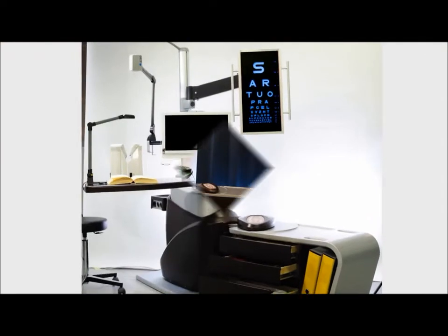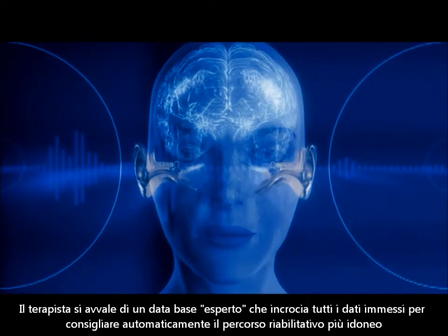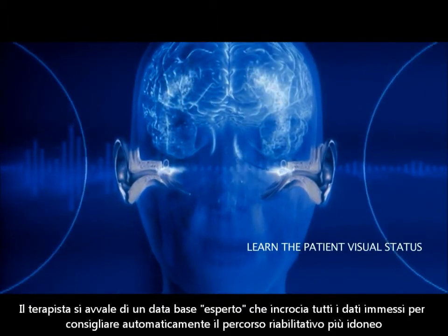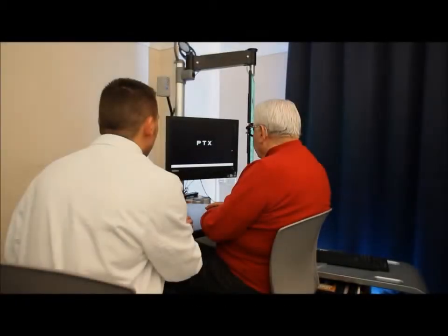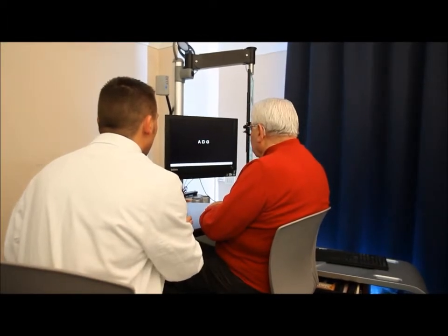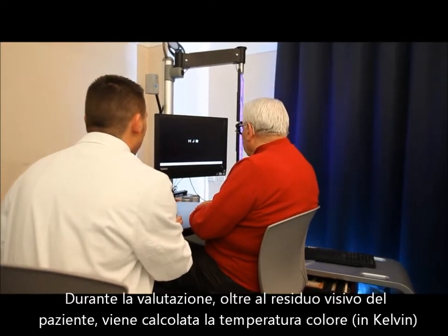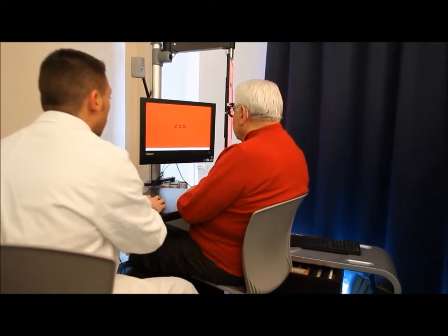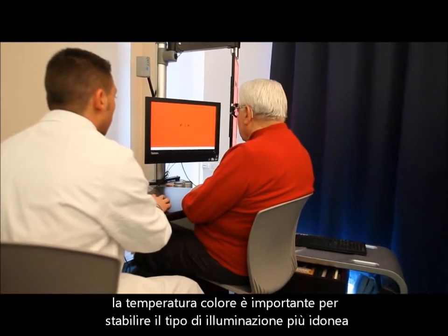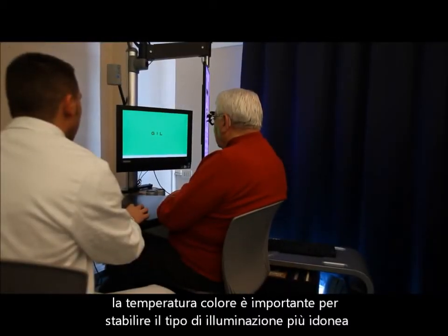The brain of the Low Vision Workstation is an expert database that, through specific tests, can determine the patient's residual vision and the most suitable color temperature. To determine the visual acuity and the color temperature with which the patient has obtained this result, the optotypes that are employed are not only those that give the best contrast, white letters on black background, but also those with black letters on various colored backgrounds, such as red, green, and blue.